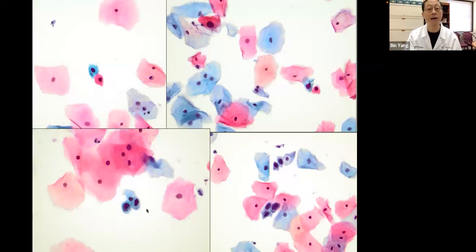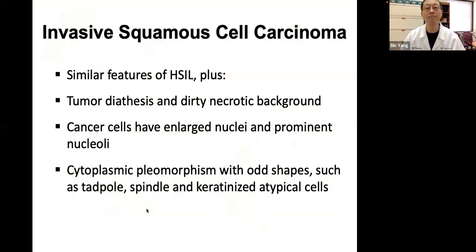And this is another one. Apparently, they look just like H cells, but I only have a few, like a dozen cells. It's a woman less than 30 years old. I call ASC-H. So there are a few situations like this. I have a couple of ASC-H in the postmenopausal. It's really hard to take a picture, and they're all dark, and I just gave up. It's a good look at the scope, but not good to show in this lecture.